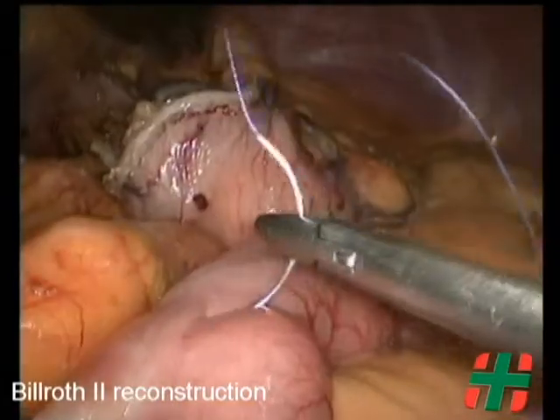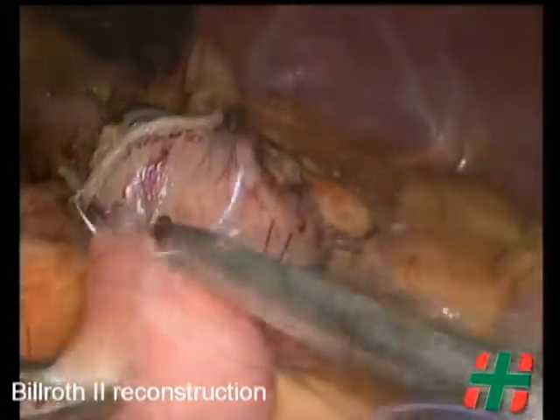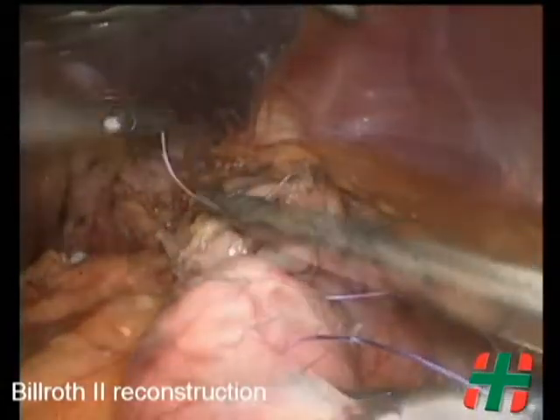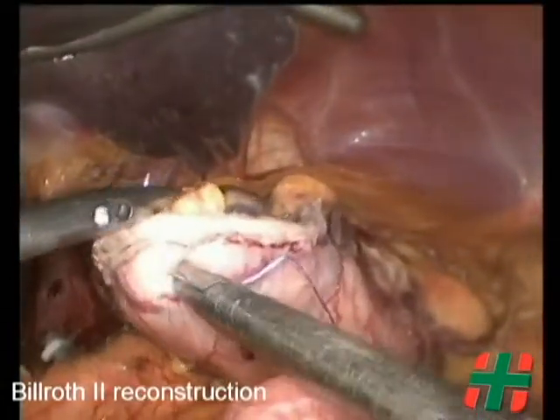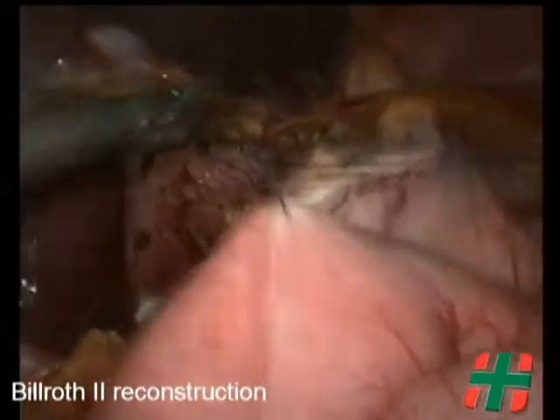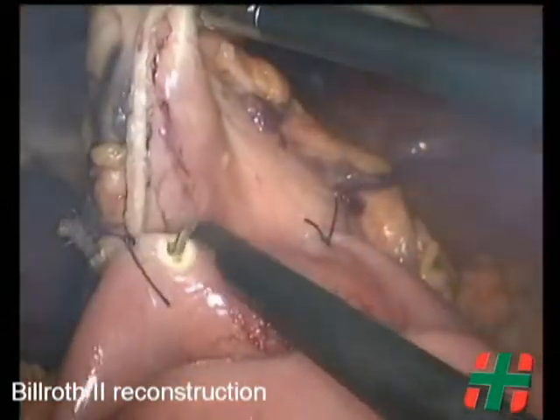For a subtotal gastrectomy, Billroth II reconstruction is performed using a linear stapler blue load, and the defect is then closed with a running 3-0 absorbable suture.